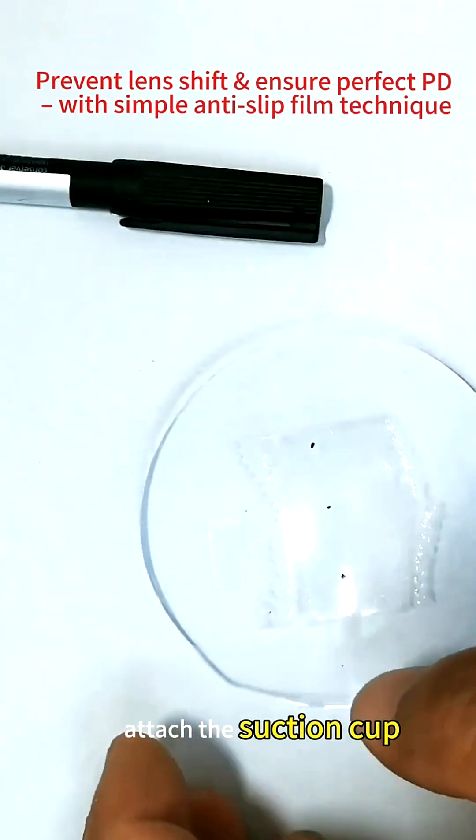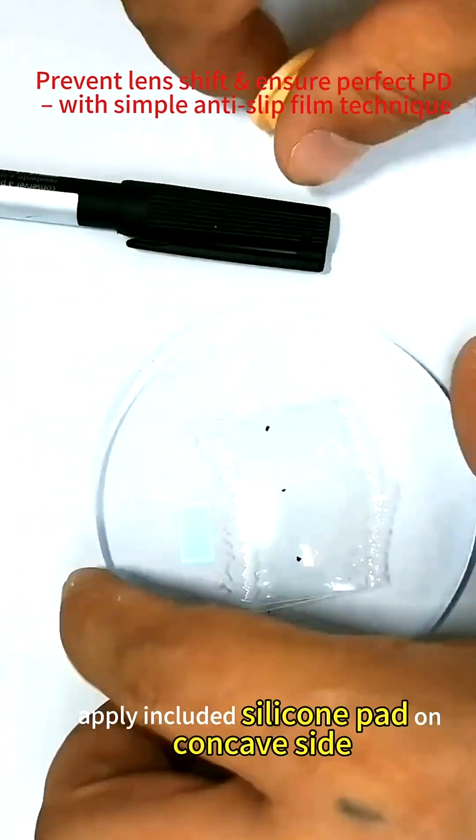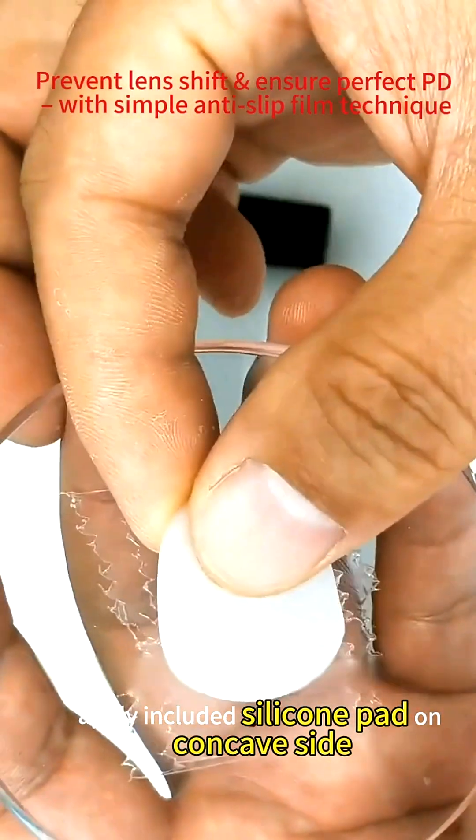Attach the suction cup. You can use double-sided adhesive or a soft suction cup — both work fine. Apply the included silicone pad on the concave side.